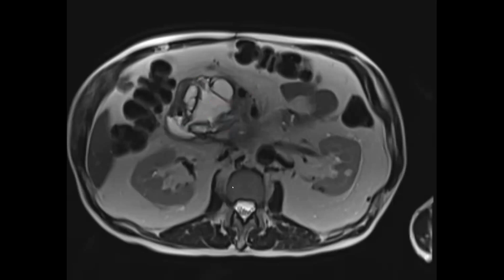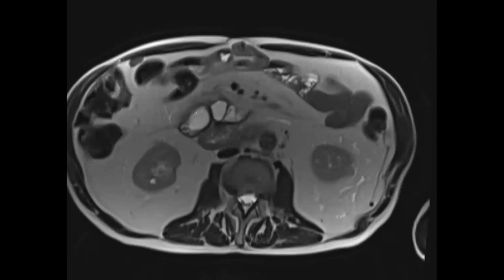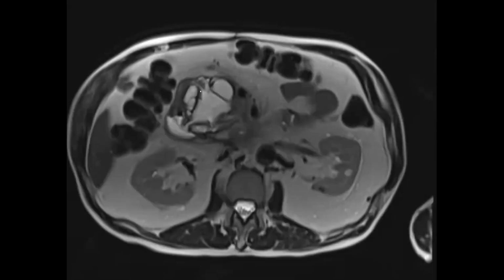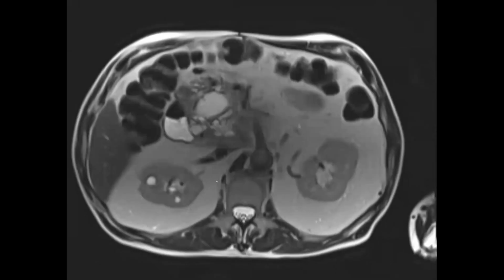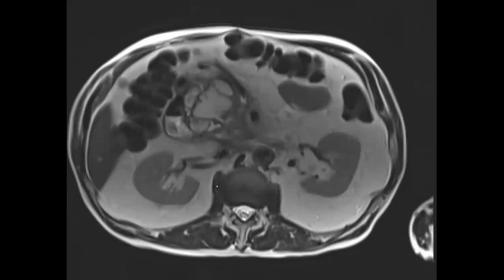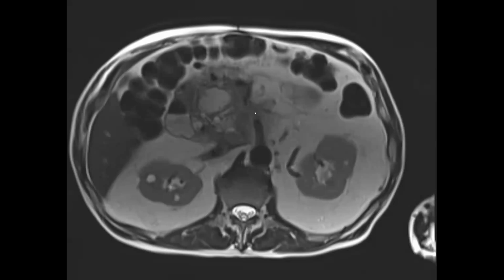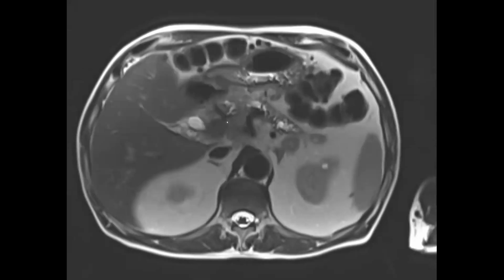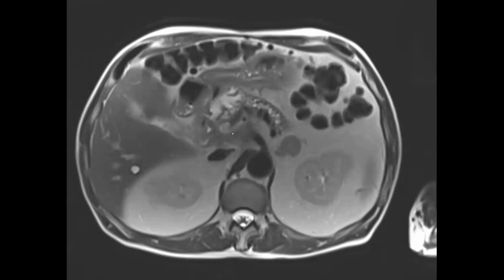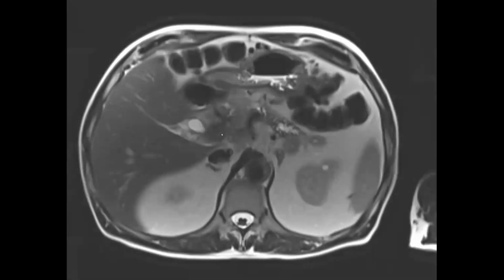So you can see that it's bigger. But do you see anything else? So that is super engorged. Lots of dilated side branches. So there's now a lot of soft tissue that is encasing the flow void of the SMA and even up here in the celiac axis and going into the portal hilum here. And then the portal vein is also almost basically obstructed.